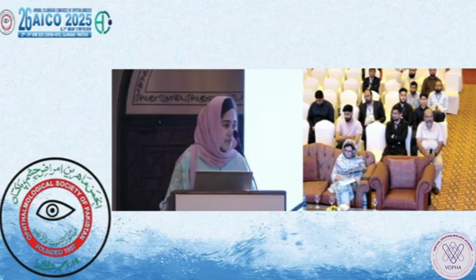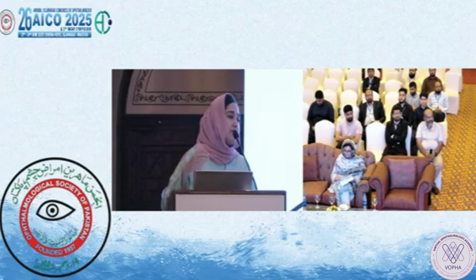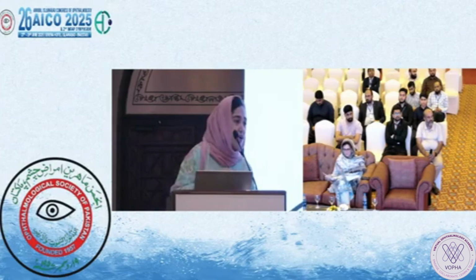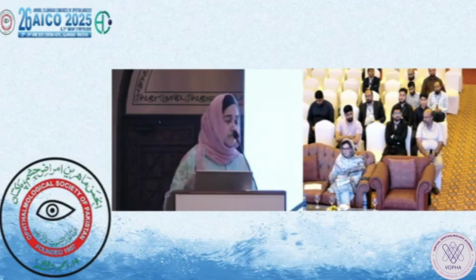Thank you very much. So what are its drawbacks? I was trying to compare both the drawbacks. The studies suggest that the long-term visual acuity of both may be the same, but the drawbacks of the anterior chamber IOL are furthermore corneal decompensation, uveitis, glaucoma, hyphema syndromes.